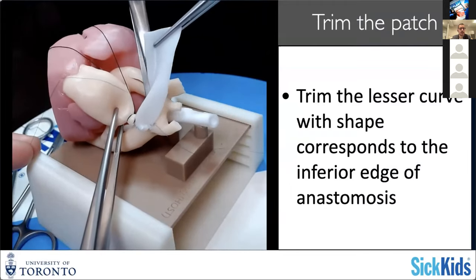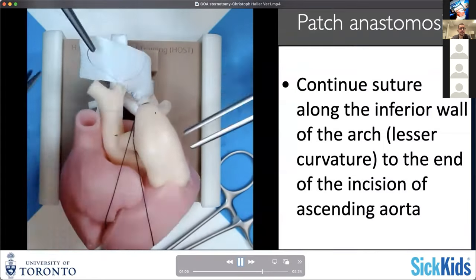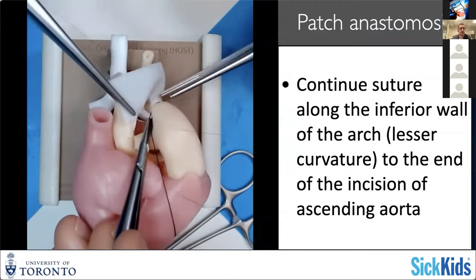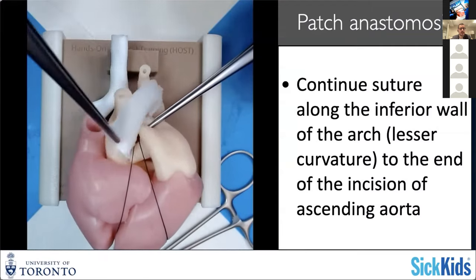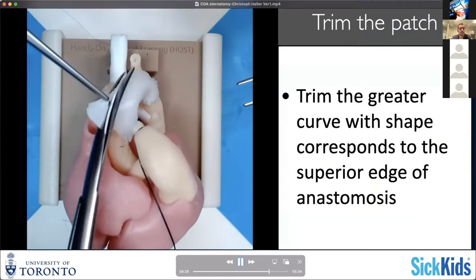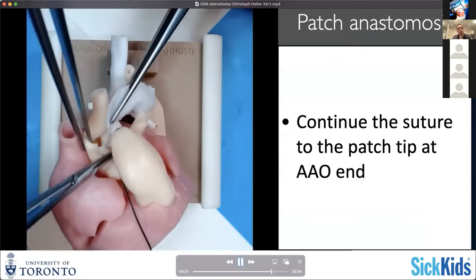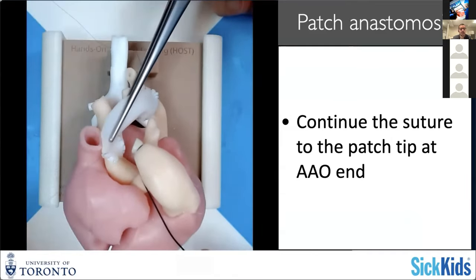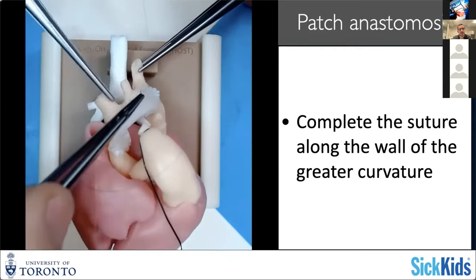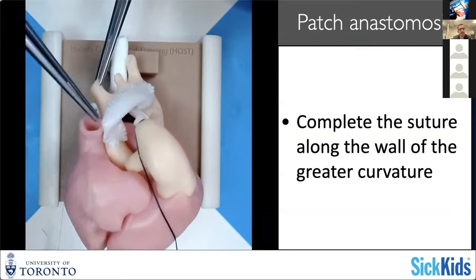That's a time point where you can adjust the angle - usually I would have a bit more of an angle here. Then you run that suture line further. As you're coming more anterior, the placement of these sutures becomes much easier and exposure is much easier, so that's where you can gain a little bit in time. At that time you can also remove the clamp on the descending aorta, and see how basically the backflow from the descending aorta lifts up your patch and creates the hypothetical shape of the filled aorta. That can guide you in terms of how you shape your patch accordingly, and then you run your suture line further right into the ascending aorta.